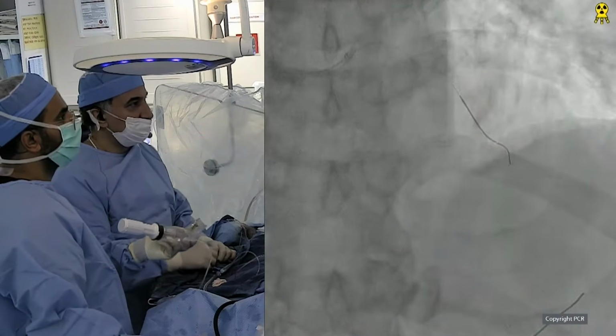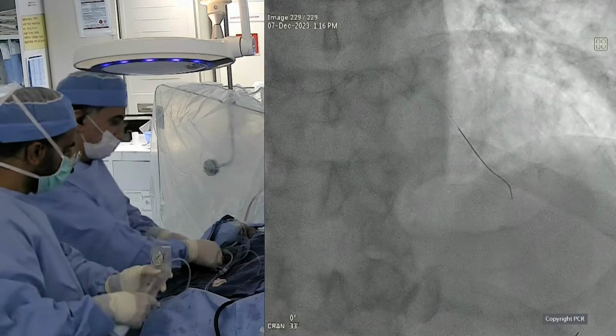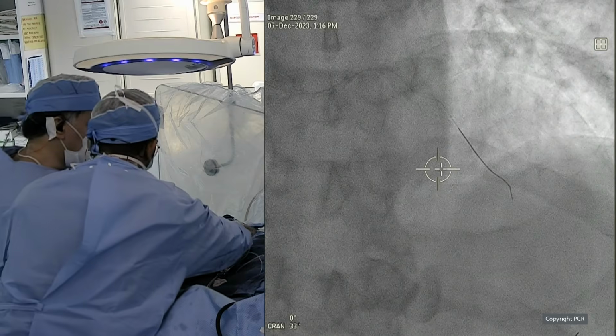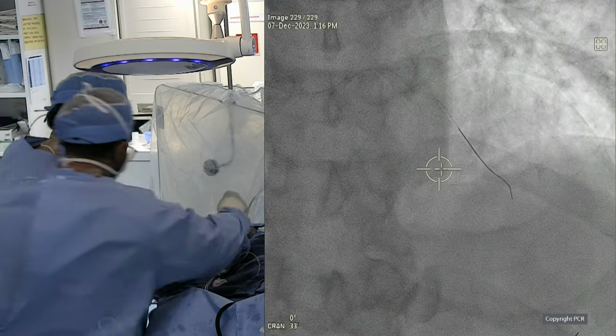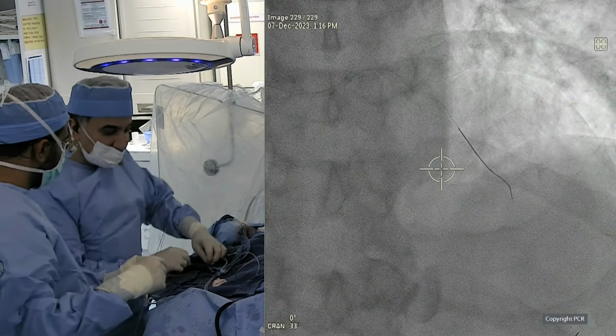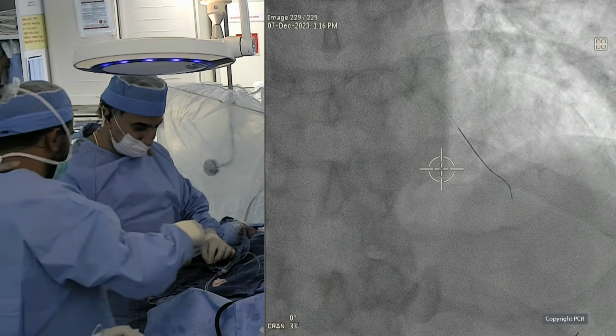And also because the longer the stent, the more we are going to get in trouble crossing the first part. Well, you're picking up friction on the way, so the longer the stent, the more friction. Give me the guideline, please. Or give me another anchor. Will they hold all the way?